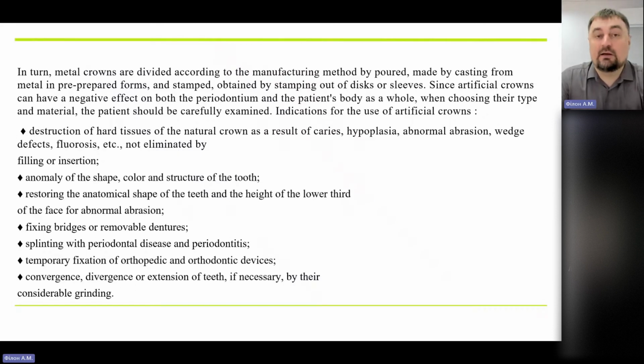faster than before, because before, when we asked our laboratory to make metalloceramic crowns after impressions, it took about 1 week. Yes, 1 week minimum to make that metal carcass, place the ceramic on it, and then polish it later.